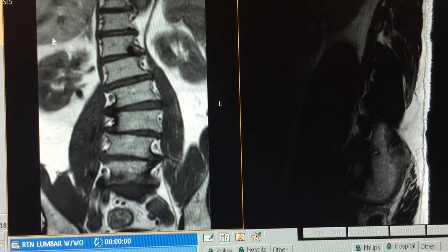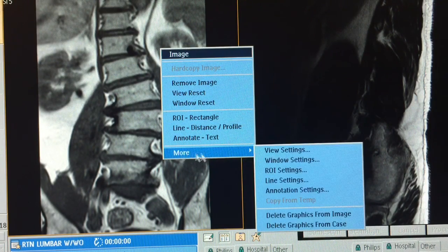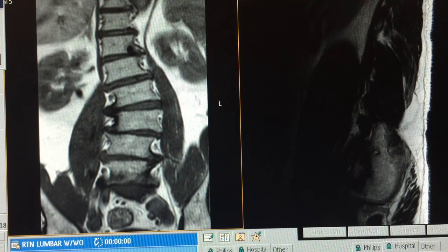Hello folks, we're on the Philips Ingenia platform 4.1, attempting to measure the Cobb angle on this coronal lumbar spine. Right-click here and we'll quickly go to more options and select line settings to bring the menu up.